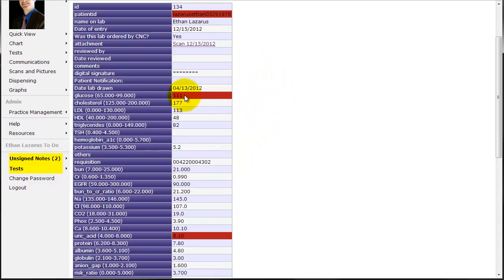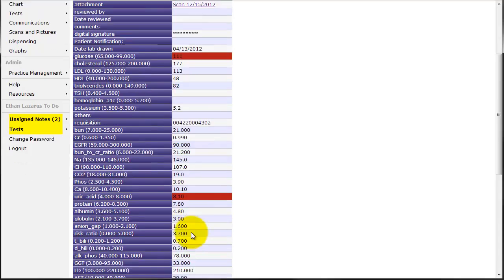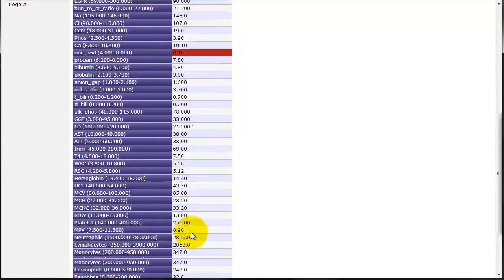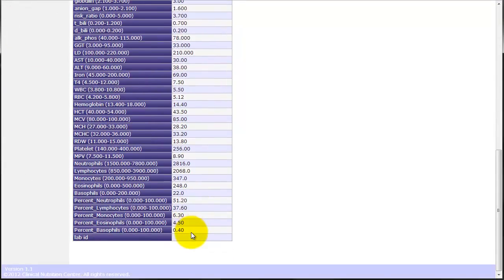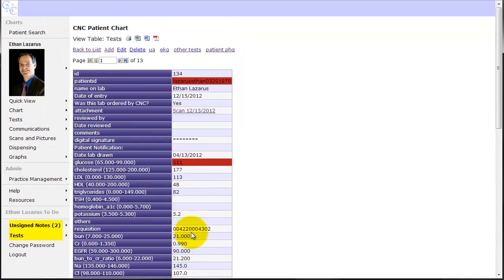You can see the blood sugar is above the normal range. The uric acid is outside of the normal range. And the rest of the labs are in the normal range.